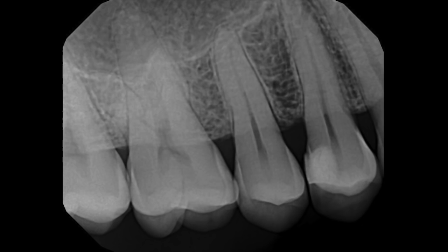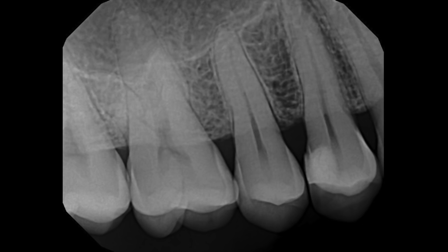Okay folks, we're back inside in the safety of our hotel room and away from the wind tunnel that is the Varadero beach. I have a case for you and it's a maxillary first premolar, the maxillary right first premolar.